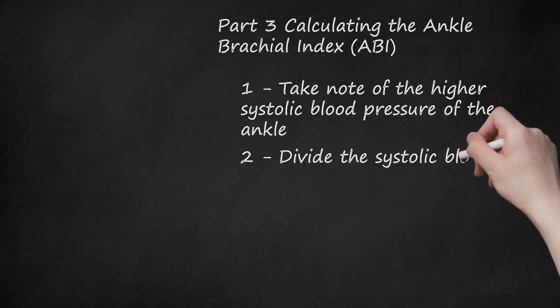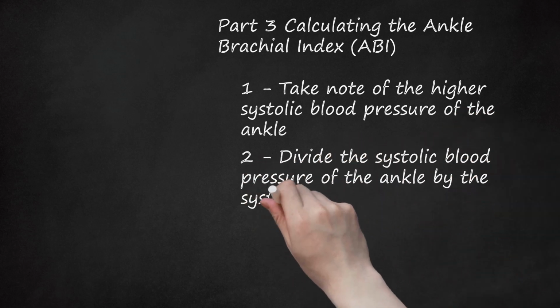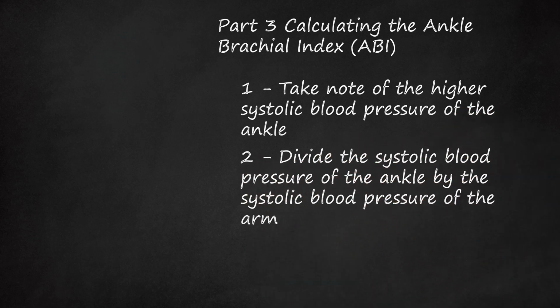2. Divide the systolic blood pressure of the ankle by the systolic blood pressure of the arm. You will calculate the ABI for each leg individually. Use the highest value from your readings of the left ankle arteries and divide it by the value of the brachial artery. Then repeat this process with the results from the right ankle.